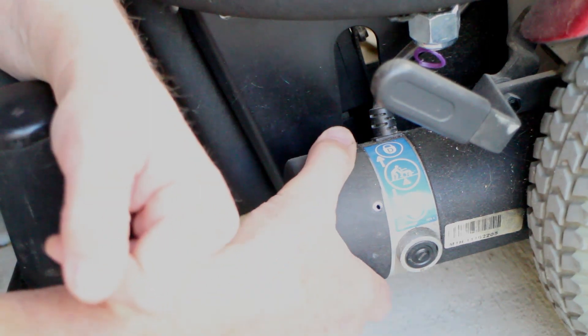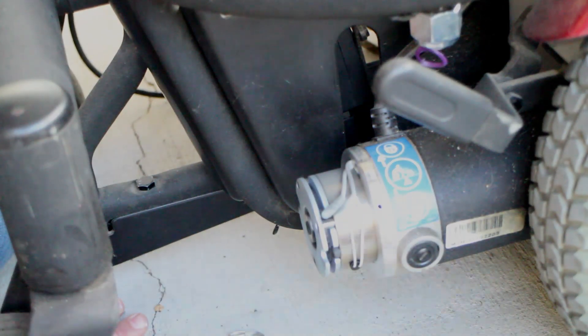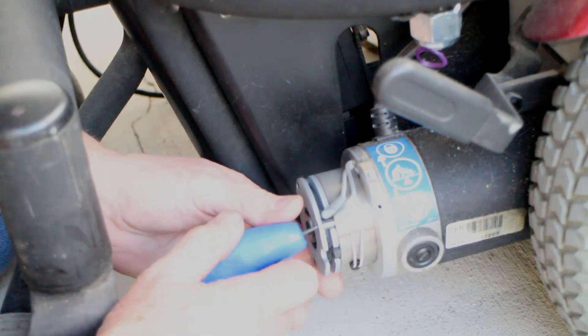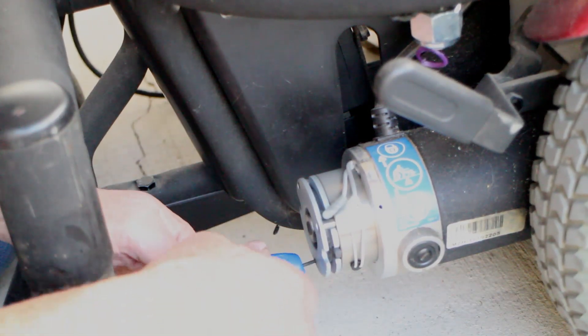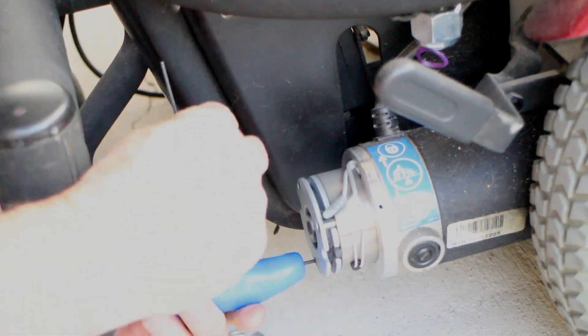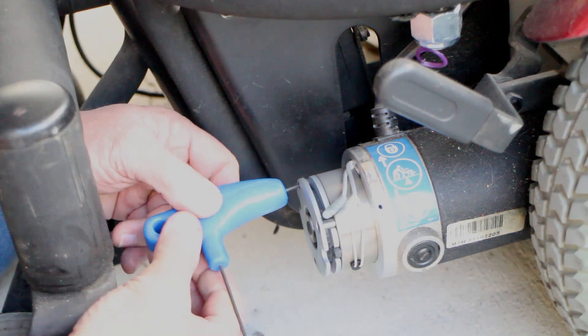After removing the cover, I took the two millimeter wrench and removed the three screws on the face plate. I'd originally thought about showing this process in real time so you could see exactly how long it took, but it was frightfully boring so I've cut some of that out.